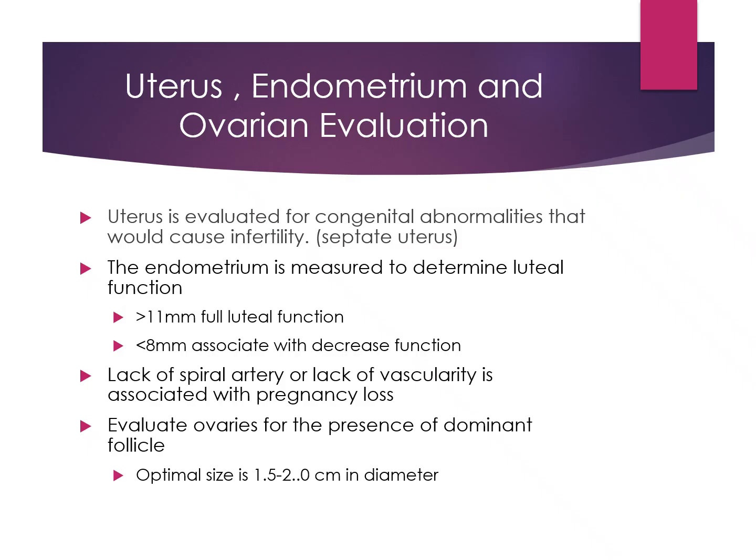And so they'll come in after this year and they'll do an ultrasound, and we're checking the uterus for any congenital abnormalities, right? So that septate uterus, if they have a complete septation there, they can have that surgically repaired, which will then allow them to have children, or any other type of abnormality in the shape of the uterus. And we talked about those. If you're not really quite sure, go back to the anatomy video and look over those and know those different types.